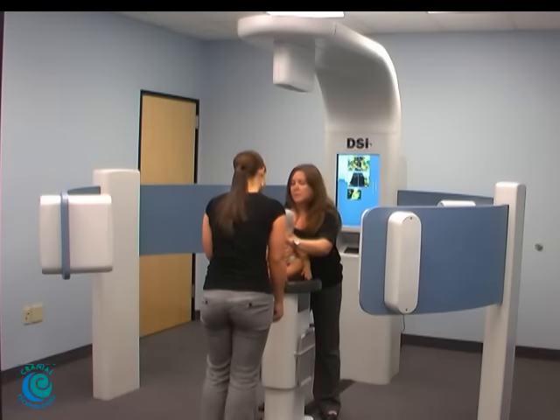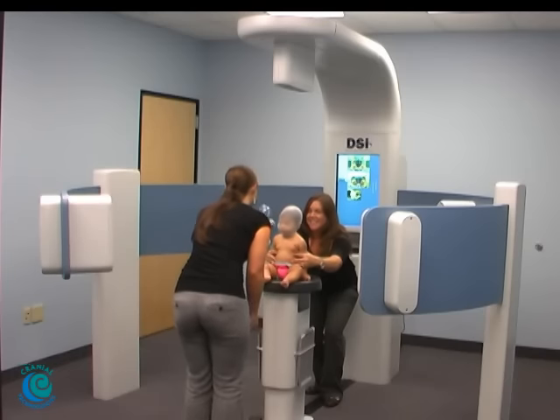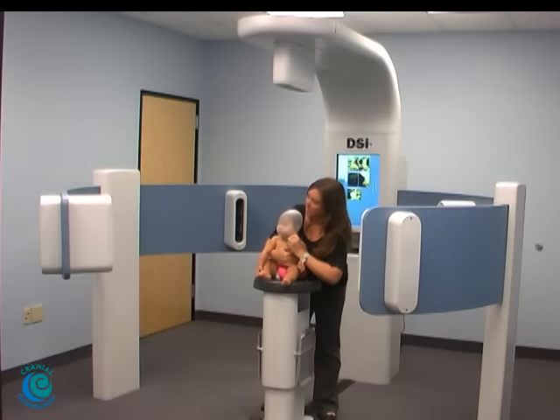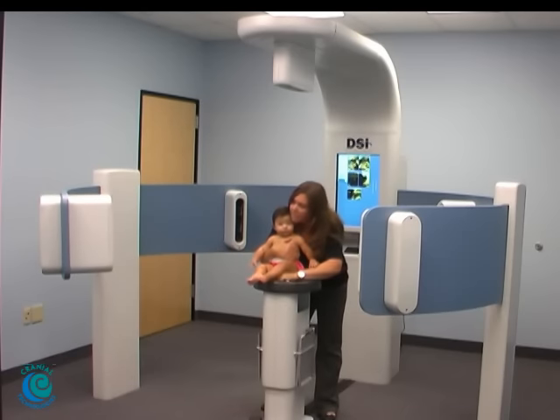Let's see, sweetheart, one more. It died — that's not good. Let's see, sweetheart, what's this? Sophia. There we go, that was perfect. Yay. All right, you ready? Here. There we go. All ready.